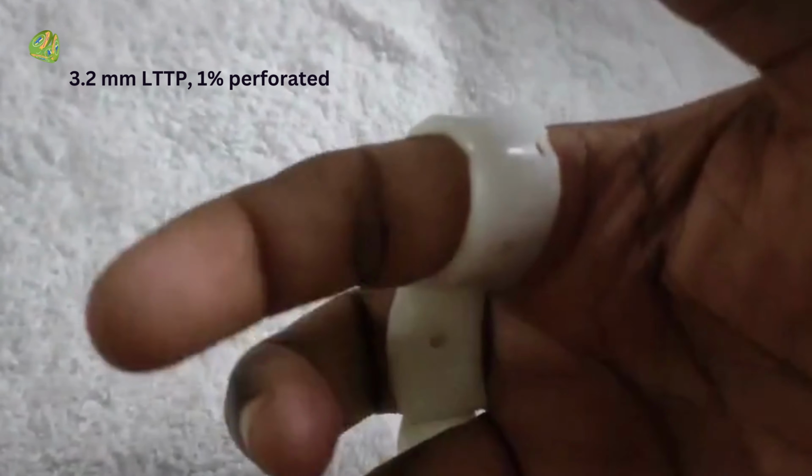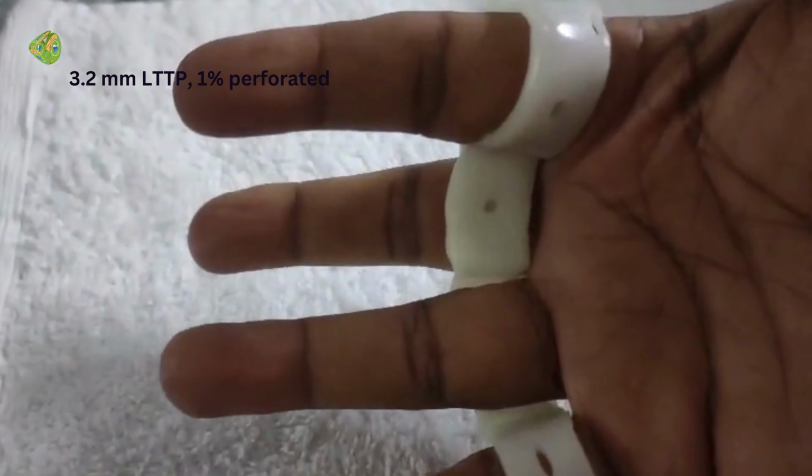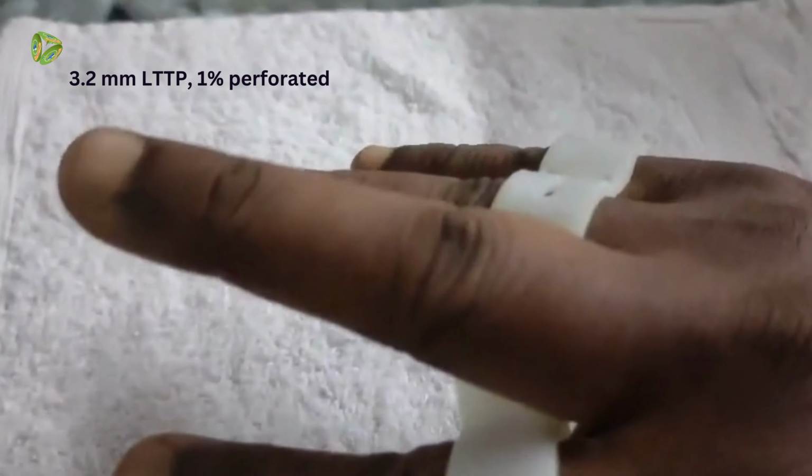This yoke splint or relative motion orthosis was fabricated using a 3.2 mm perforated thermoplastic sheet, keeping the middle finger extended at 20 degrees relative to the MCP of the other fingers. This orthosis allows a full flexion of all the joints of the other fingers and the PIP and DIP of the middle finger as well.